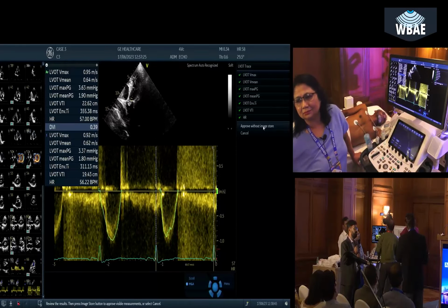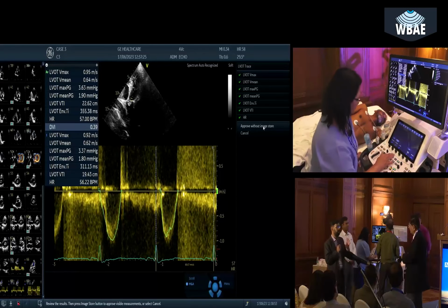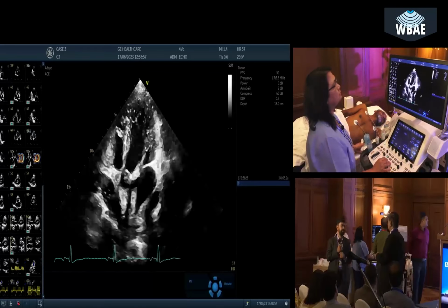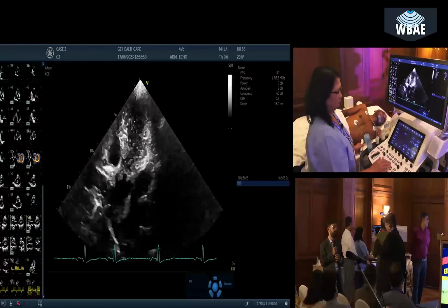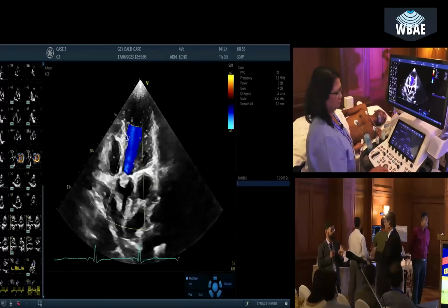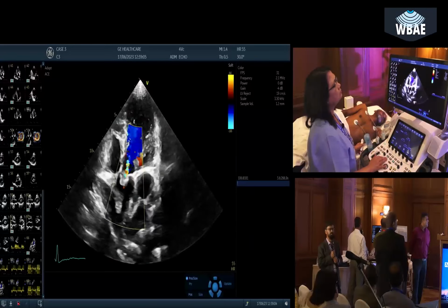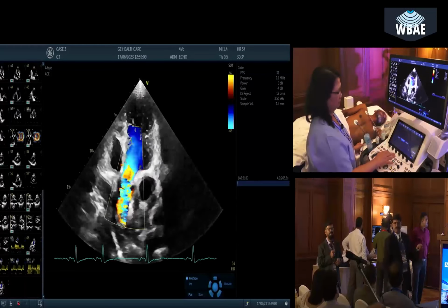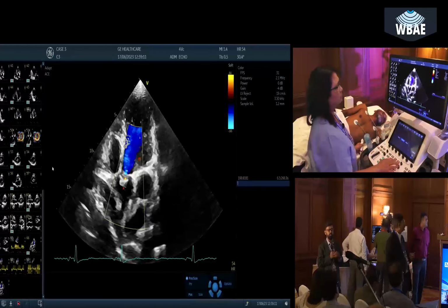Dr. Madhu, can you try to get the gradient of the aortic valve better, by adjusting the angle? Yeah, but sir, is not the MS flow affecting the aortic valve flow? No, but we have measured the aortic valve area by planimetry. That's 1.2. That's why I'm saying it is robust. Yeah, it will come the same, 1.1. Say 1.2, 1.1, 1.2. So it becomes more.